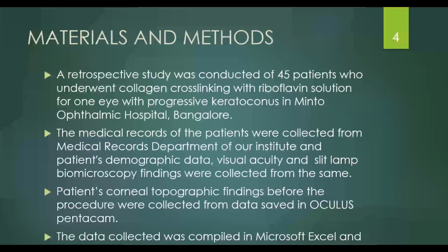Materials and methods: a retrospective study was conducted in a hospital of 45 patients who underwent collagen cross-linking with riboflavin solution for one eye with progressive keratoconus. The medical records of the patients were collected from the medical records department of our institute, and patients' demographic data, visual acuity, and slit lamp biomicroscopy findings were collected from the same. Patients' corneal topographic findings before the procedure were collected from the data saved in Oculus Pentacam. These data were compiled in Microsoft Excel and statistical evaluation was done.